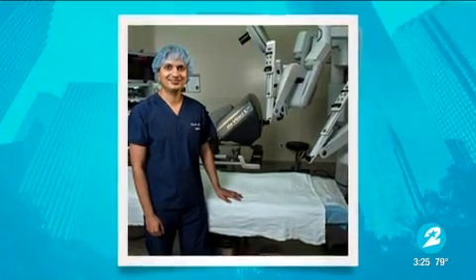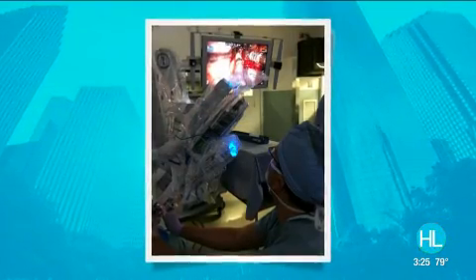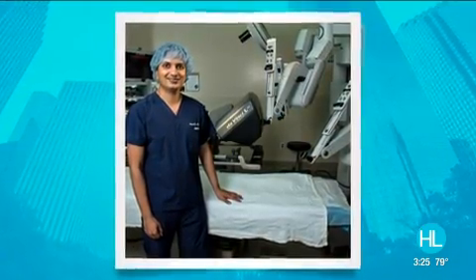Hi, thanks for having us. Transoral robotic surgery is, we used to have to do surgery where we kind of split your jaw to take cancers out in the back of your throat. You'd need a tracheostomy, which is like a breathing tube in your neck, and a feeding tube. But now with the robot, you're actually able to place the arms of the robot in the patient's mouth, as in Mr. Bush's case, while you work on a console kind of far away from the robot, and your assistant is by the bedside. You avoid all those things, and that way patients are able to get out of the hospital in 2 to 3 days rather than a few weeks. They're able to potentially avoid chemotherapy and radiation therapy. The robotic surgery probably started about 10 years ago in our field, and we're really using that more so for throat cancer patients.